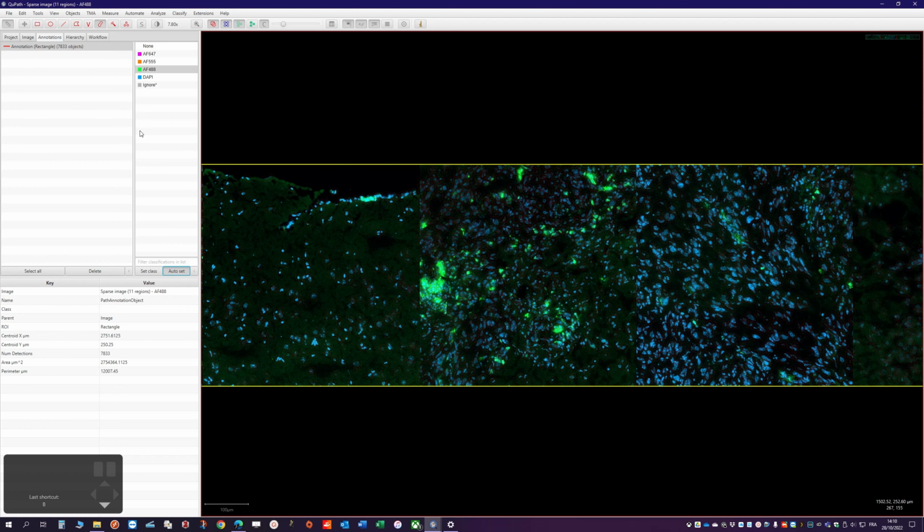Usually I don't talk that much about shortcuts, but here, since we would constantly switch from the brush tool to the move tool, or hand tool, it's B and M on your keyboard, so you can just click on B, M, like this to quickly switch from one tool to the other, which is quite nice.